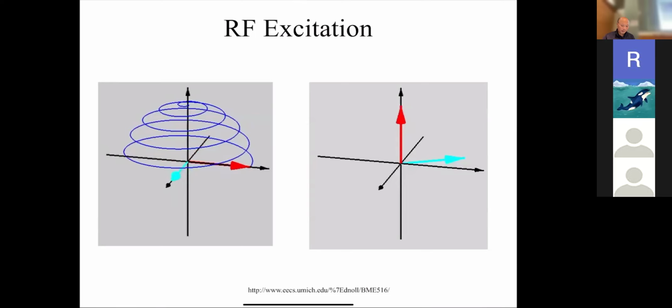Now, the next example I'm going to play is where I'm slightly off frequency, right? Let's say you're running too slow or running too fast such that your pulls are not efficient. Then what's going to happen is that the magnetization is just going to sort of stay close to where it is. So for now, we're going to talk about ways of getting the magnetization down. Later on in the course, we'll talk about how in some places you might want to leave it up, and in some places you might want to bring it down, okay?